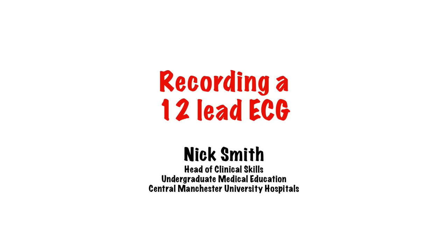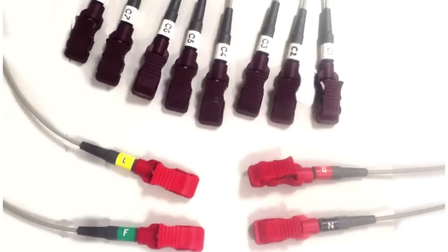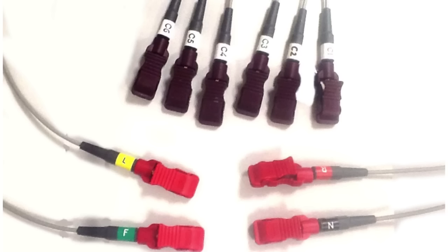Hello, my name is Nick, and welcome to this short video on recording a 12-lead ECG. The first thing to point out here is that although it's called a 12-lead ECG, there are in fact only 10 physical leads to put on, so don't go looking for two more.